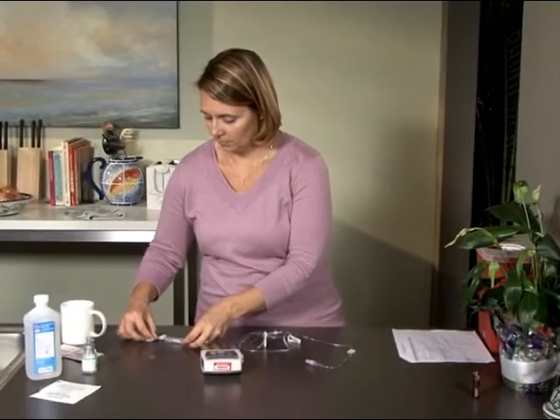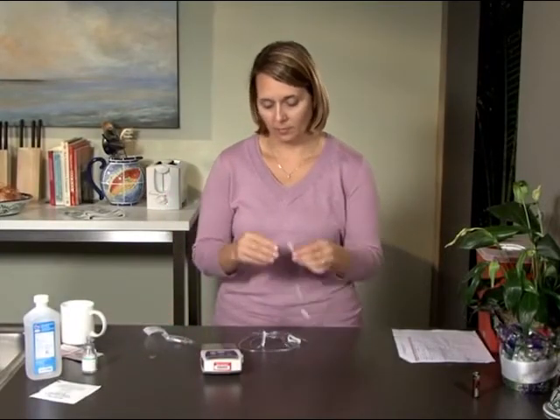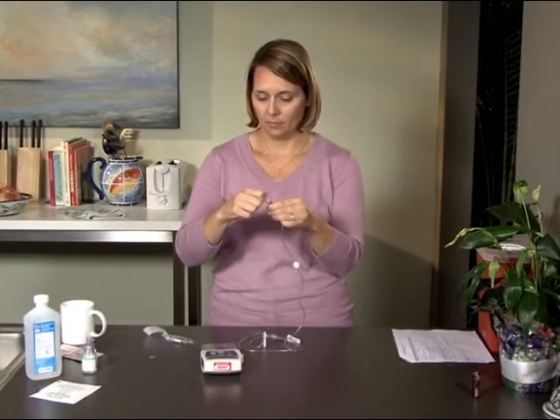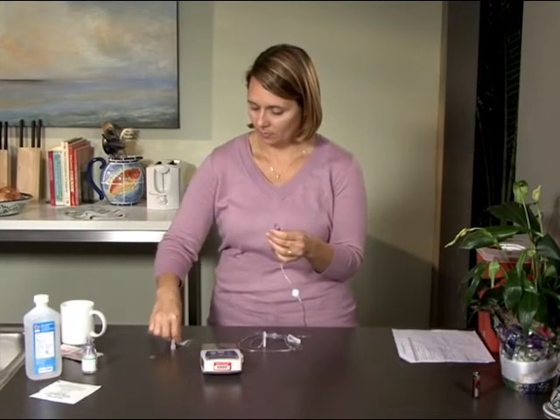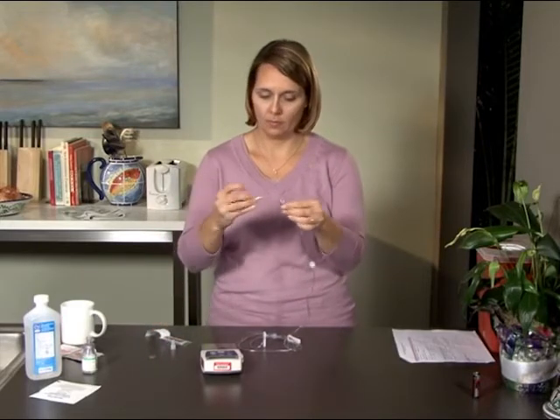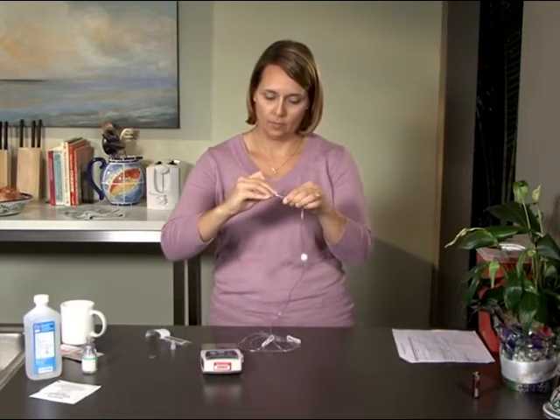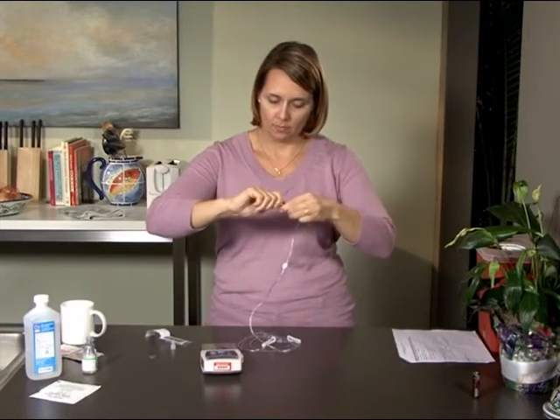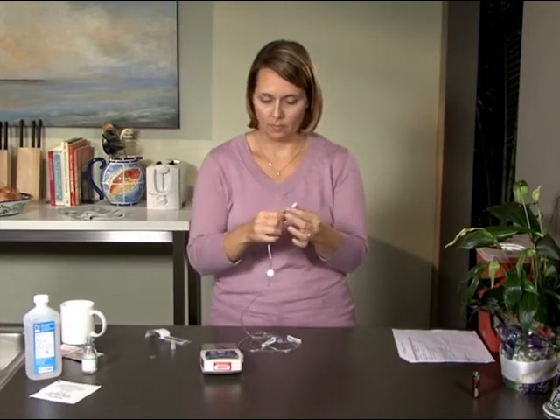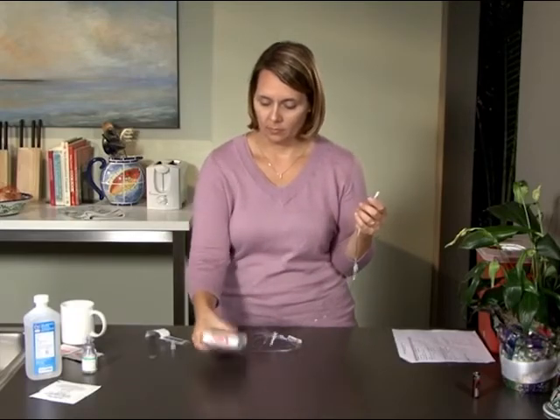First, clamp the central line. Disconnect the current pump by twisting off the extension tubing and set it aside for storage later. Clean the end of the central line with alcohol. Remove the clear cap on the end of the extension tubing. Attach the extension tubing to the central line, then unclamp the central line.